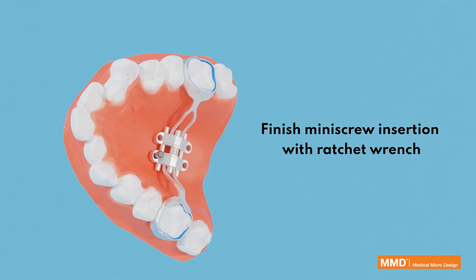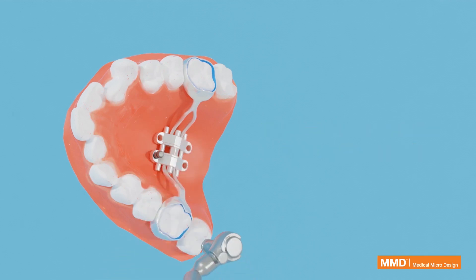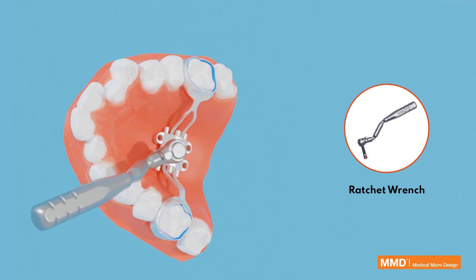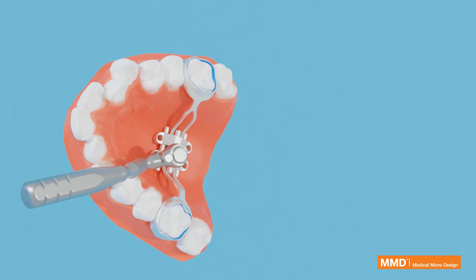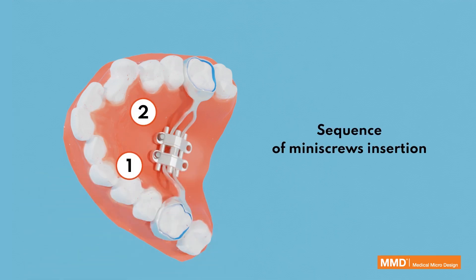Finish miniscrew insertion with the ratchet wrench. Follow the correct sequence of miniscrew insertion.